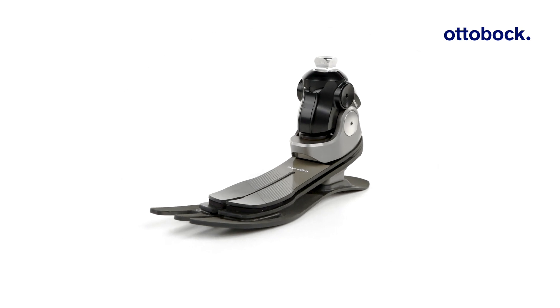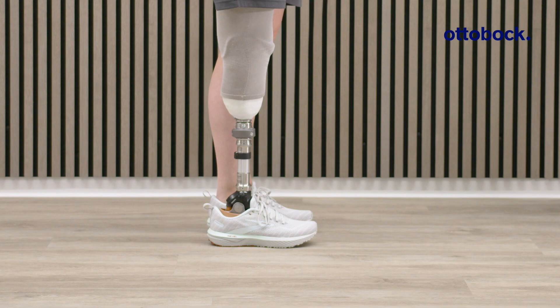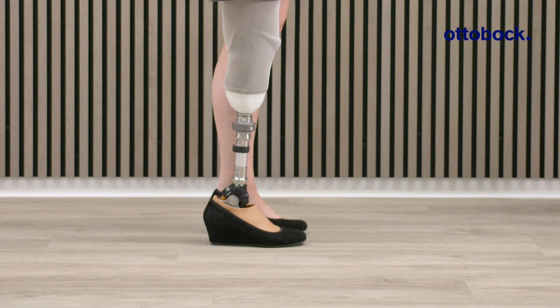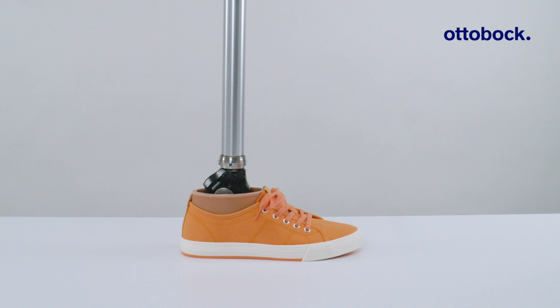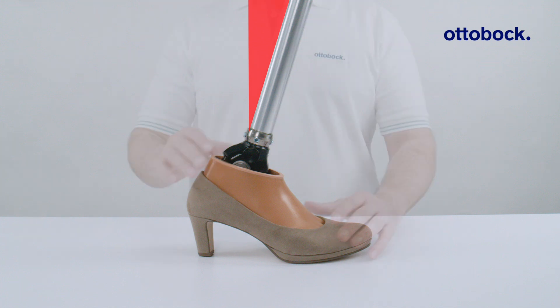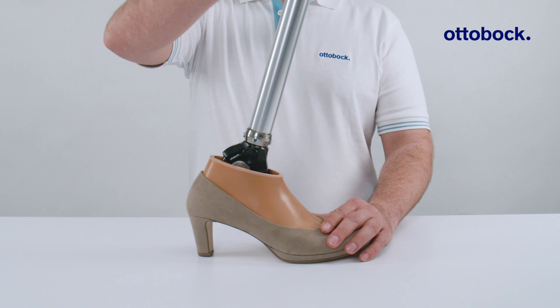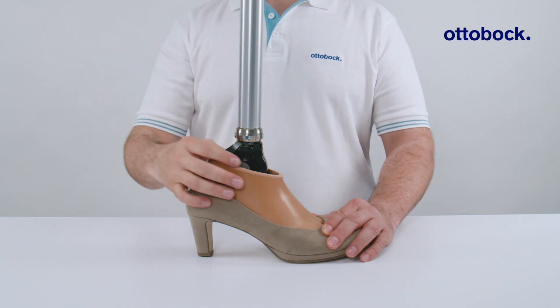The Taleo Adjust is a heel height adjustable carbon fiber foot designed for moderately active users with mobility grades 2 and 3. The adjustable ankle allows shoes with an effective heel height of up to 7 cm to be worn. With conventional carbon fiber feet, a change in heel height can lead to misalignment of the prosthesis, which may cause discomfort in the prosthetic socket, skin breakdown or gait deviations. With a Taleo Adjust foot, users can easily adjust the heel height, giving them a much greater choice of footwear and allowing them to walk barefoot.